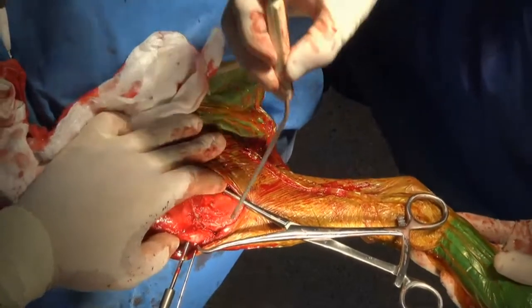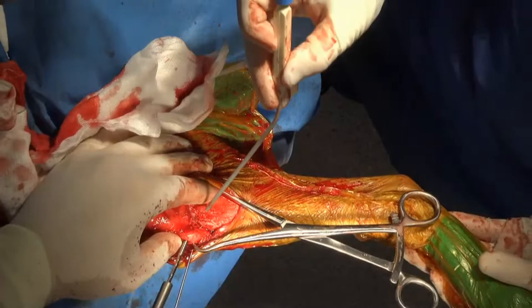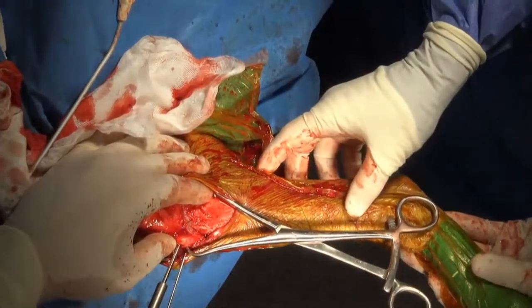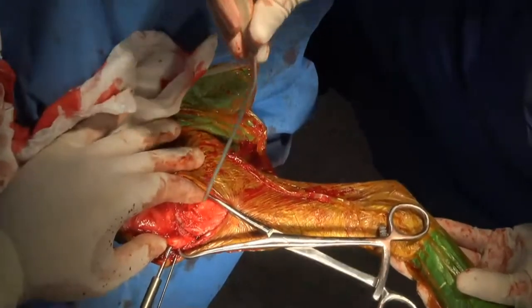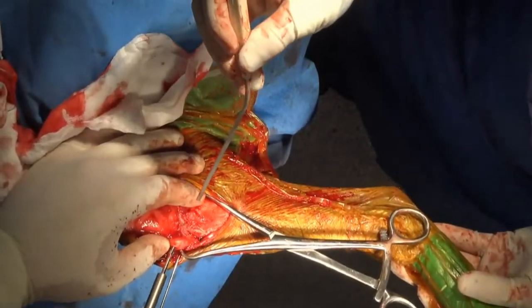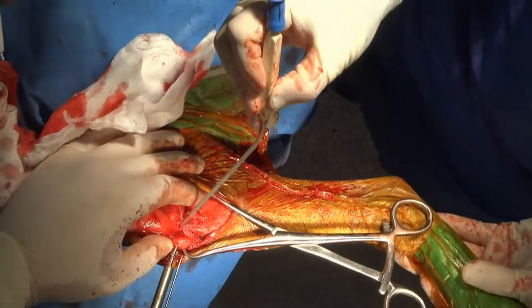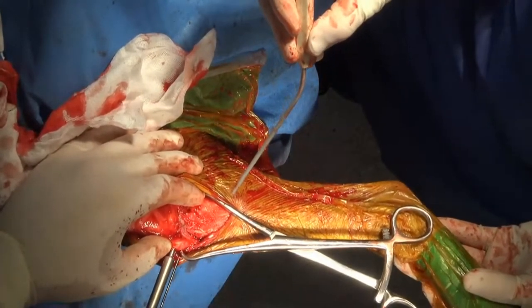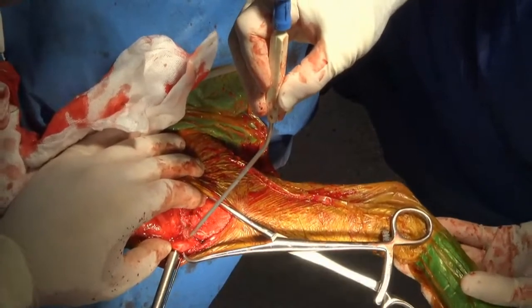So when we put these in, it's important to make sure we're checking everything and making sure nothing's moving in an untoward fashion as we're driving it. So you can feel it's engaged there. Just keep an eye on that osteotomy. I can't see it that well. So it's going across the osteotomy now, going across the metaphysis. And now it's engaging the transcortex.